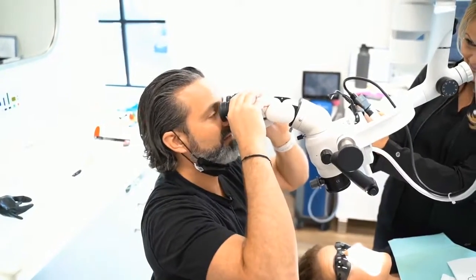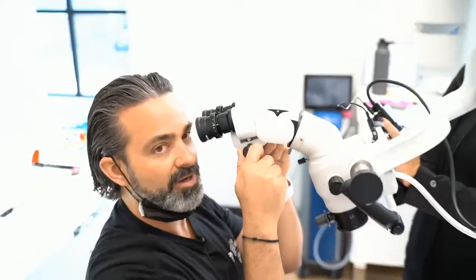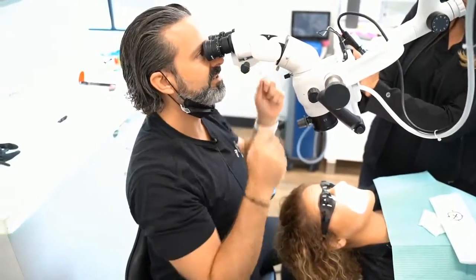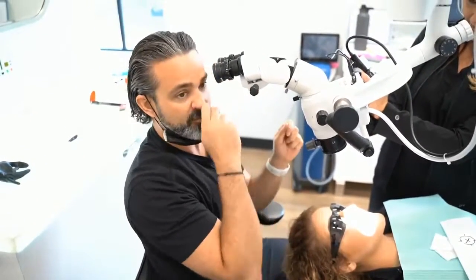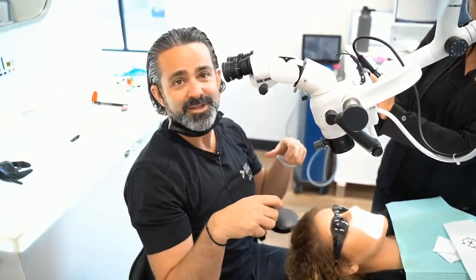now look at my shoulders, look at my arms. See how they're tucked down? And this is a lot less distance to travel and a lot more comfortable. And then you get little narrow shoulders like mine.